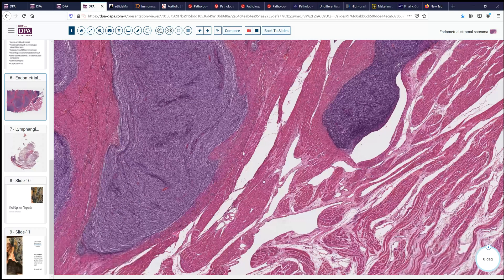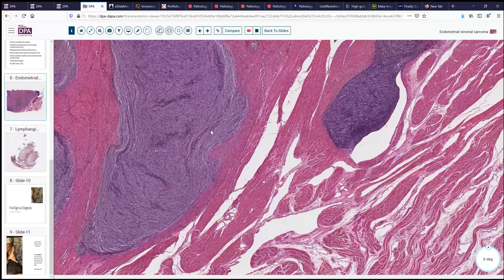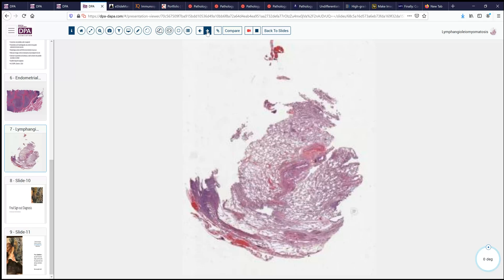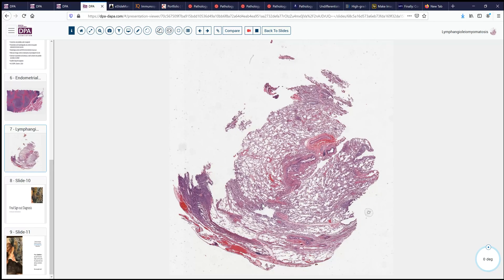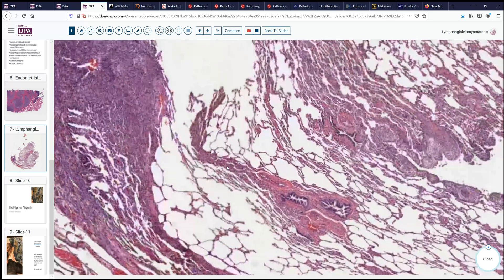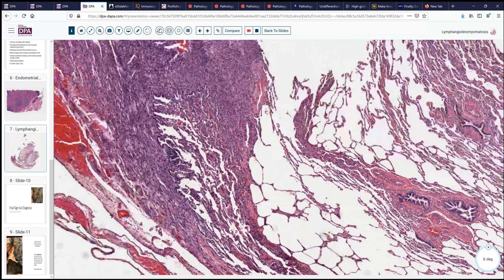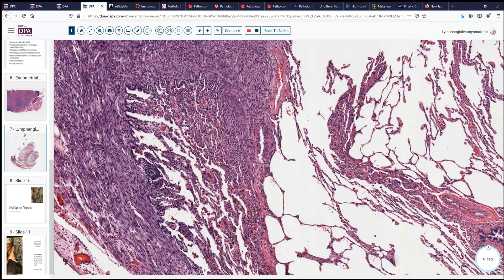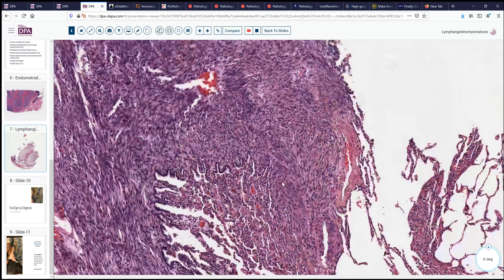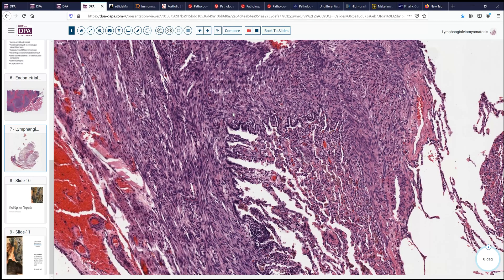Endometrial stromal sarcoma is probably more commonly encountered than intravenous leiomyomatosis, at least in our practice. Another entity that can enter the differential — though usually presenting in a different location — is lymphangioleiomyomatosis. Typically that presents in the lung. Here's a representative example of what that can look like: primarily in the subserosal tissue areas, a smooth muscle proliferation that can be fairly bland, but is not the tongue-like or nodular proliferation of an intravascular type of lesion one would expect with intravenous leiomyomatosis.